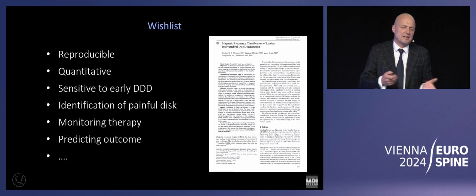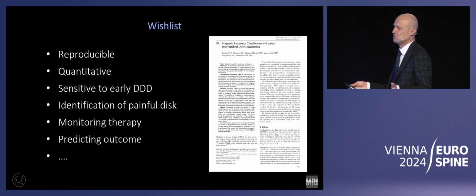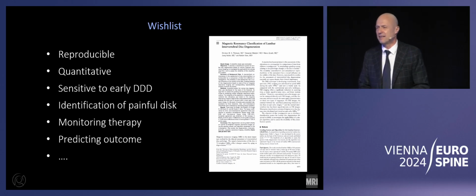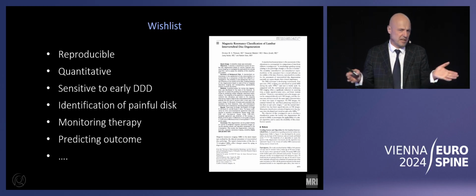We should be able to identify a painful disc. That's obviously not possible. Monitor therapy. If you have time enough, it is a good grading, but usually interventions are monitored through about 2 years, and that's not enough time for the Pfirrmann grading, because usually at that time, the grades stay the same.